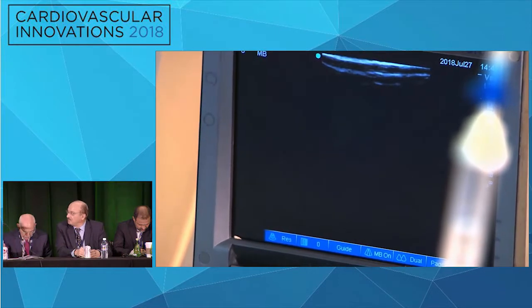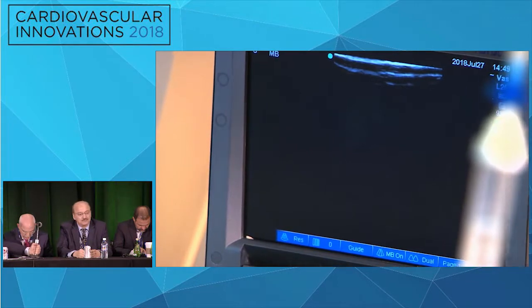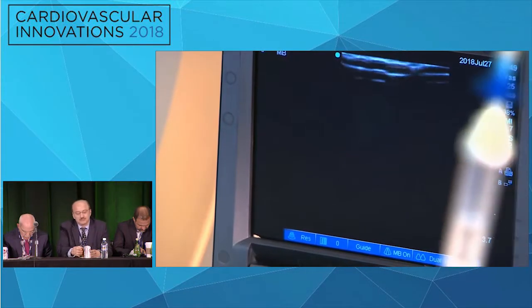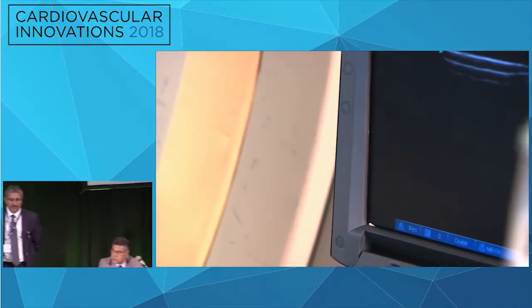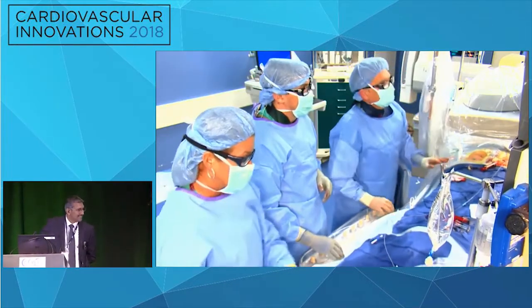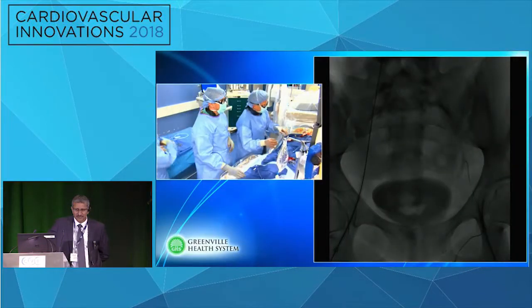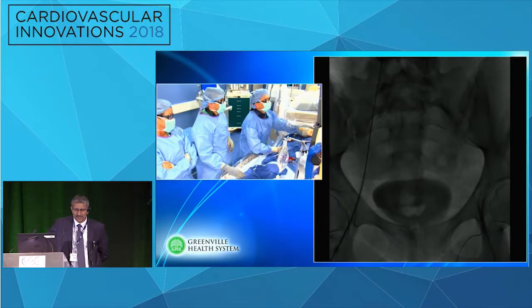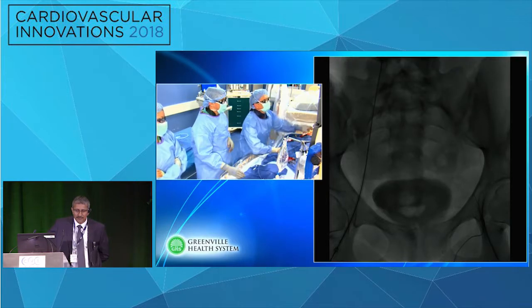So you say that at the level of the common femoral, maybe we can't do it. We keep vacillating back and forth between that left groin and here's a straight AP. That to me looks like it's starting out pretty good. Maybe we've got to go medial down in here someplace. Let's try working on the previous straight AP. Bruce, look at the previous completion shot. We ought to hit something firm there.